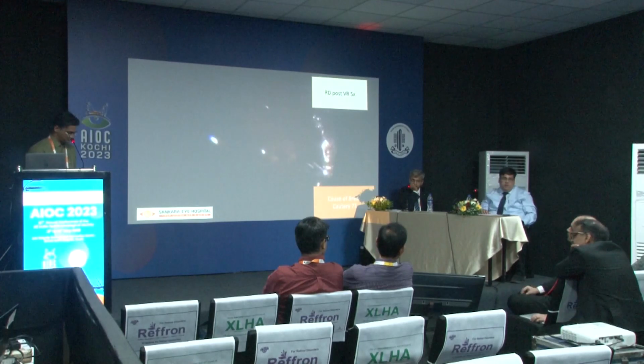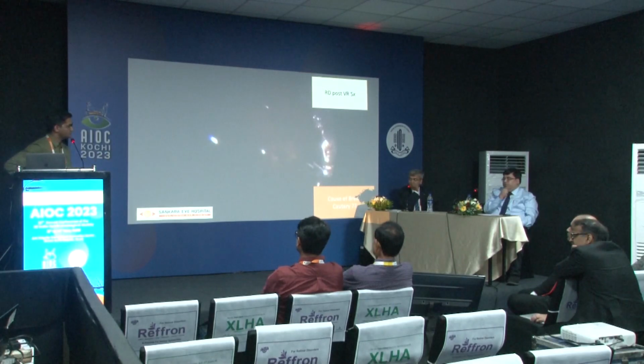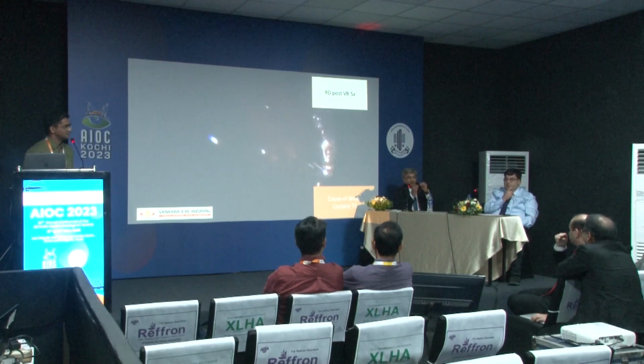Break and then laser around it. Yeah, so this was the learning which I got from this. But sometimes laser itself can cause breaks. That's a very important point. We all say, okay, we do cautery, laser around the cautery, but it's an elevated retina, there is hemorrhage, and you do the laser, you won't realize that you have created a break. You think that it's whitening, but sometimes you see smoke coming out, or a pop.